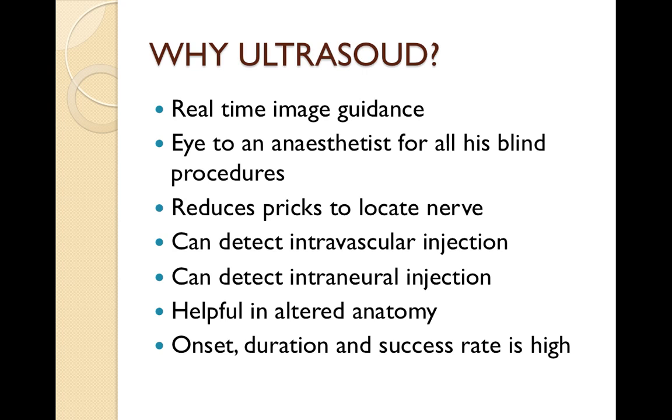As Shiv sir says, previously it was pock, pock, pock, and with PNS, you start poking the patient with a needle, and suddenly you get the twitches and you are excited. You are happy. But with ultrasound, you visualize the needle and then insert the needle.